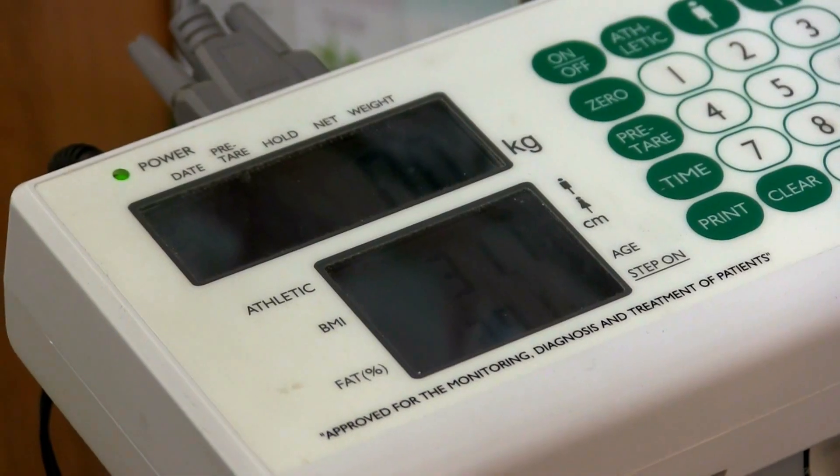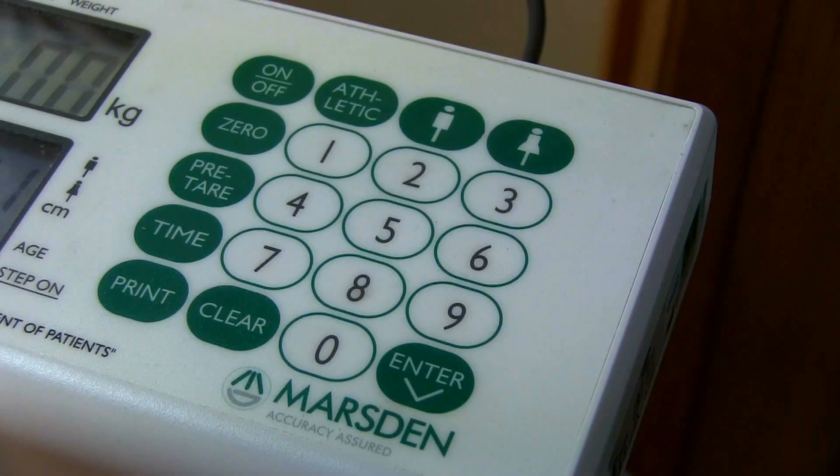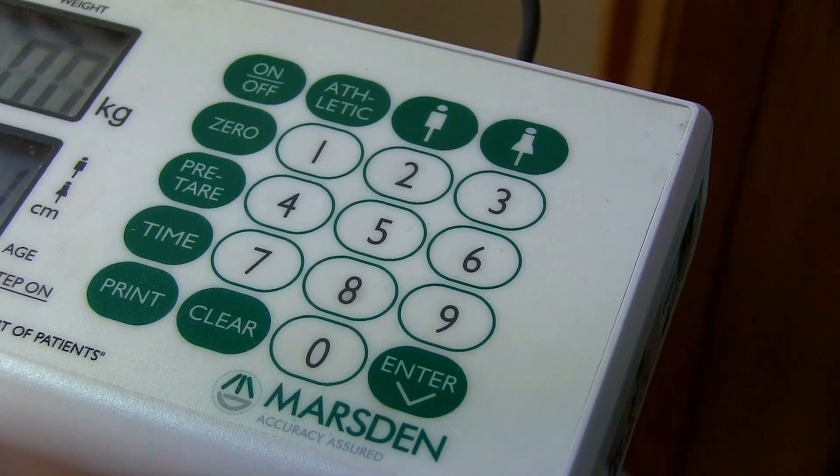I will now show you how to use this scale. Simply turn the scale on by pressing the on/off switch and two zeros will show. The scale is now ready to use.